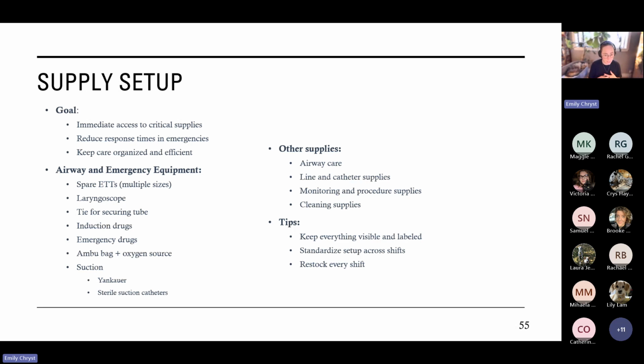And then, of course, cleaning supplies. You want to keep everything visible, organized, and labeled. You want to standardize this setup across shifts so everybody knows where everything is at all times, and then restocking every shift. Restocking is a part of patient care, especially in these cases, to make sure the next person's set up for success.